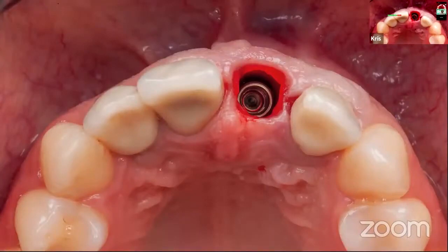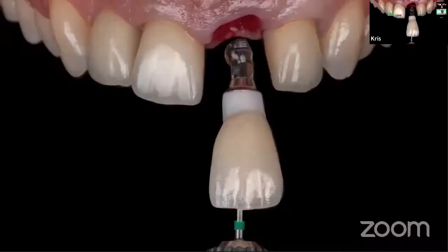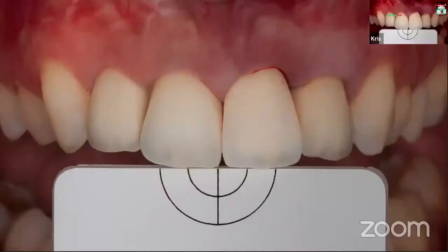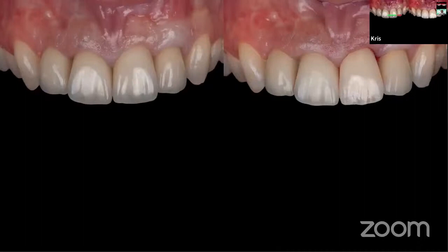The foundation of such a treatment is, of course, very precise positioning of the implant, because then we can deliver an immediately ready-to-go crown. So if you are very precise in implantation, then you can deliver such a crown. This is the crown which was delivered immediately after. The rule is that we have to have very good photographs. So this is the shot after placement, just for checking how it is in the mouth. And these are the shots showing before and after, the same day, 1 hour later, different crowns. Implant and 2 different crowns.